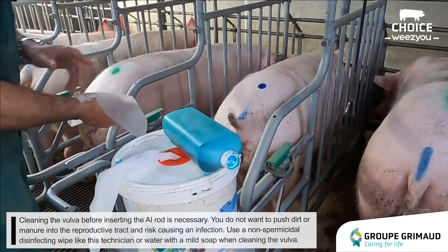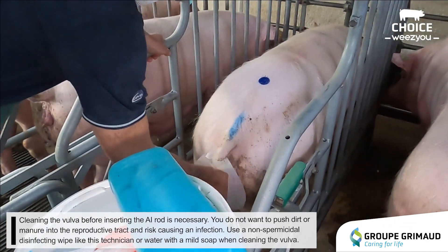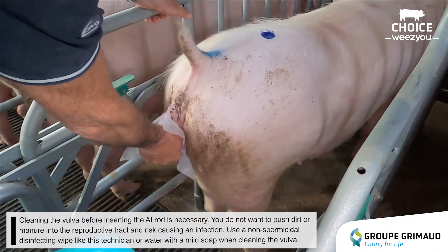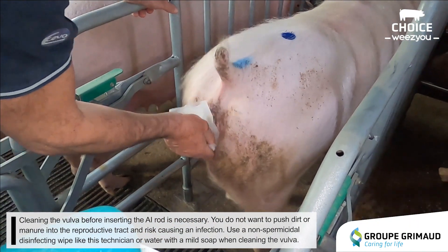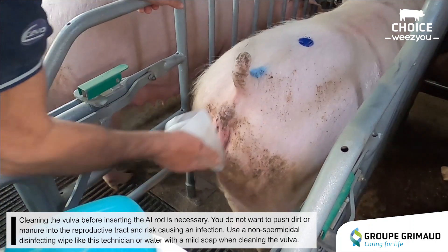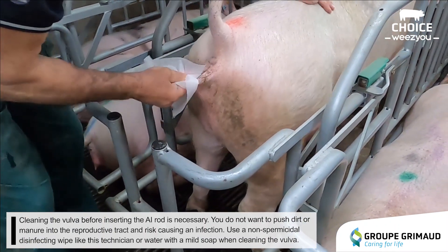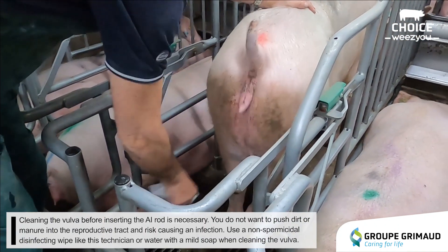Cleaning the vulva before inserting the AI rod is necessary. You do not want to push dirt or manure into the reproductive tract and risk causing an infection. Use a non-spermicidal disinfecting wipe, like this technician, or water with a mild soap when cleaning the vulva.